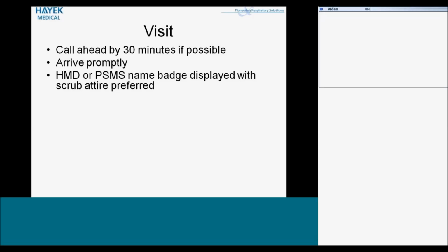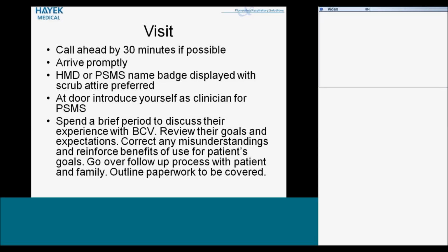Also, you should have your personal support name badge with your scrub attire. At the door, introduce yourself as a clinician. As a clinician doing follow-ups, you're representing personal support medical supply. Hayek Medical is the distributor of the Hayek, but personal support medical supply is the home care provider of the Hayek. During the brief period, discussing their previous experiences, review their goals and expectations, correct any misunderstandings, and reinforce the benefits of use. Go over what you're going to go through in the follow-up process, outline a little bit of paperwork that is to be covered with them.